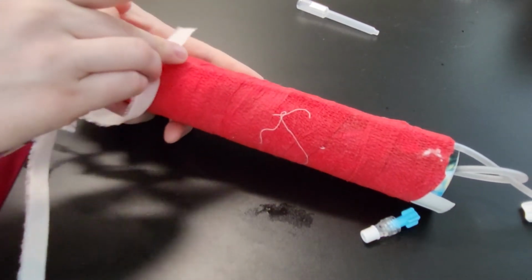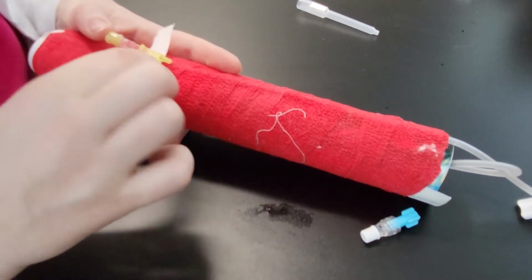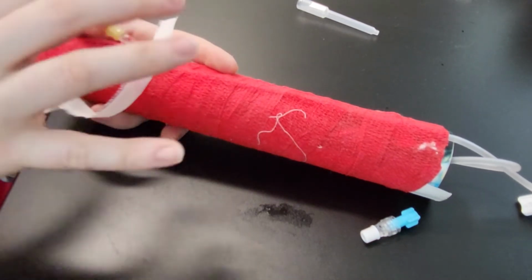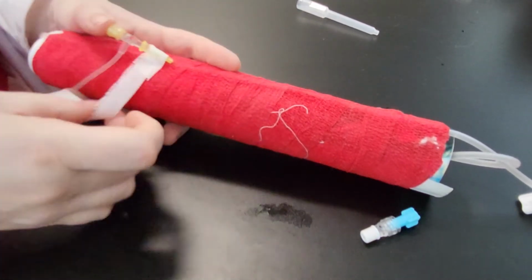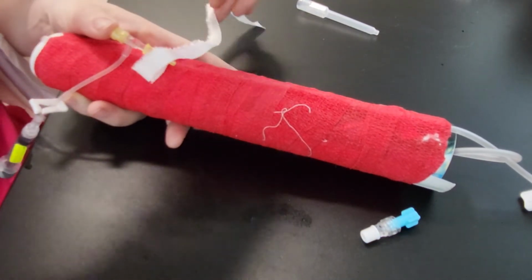When you are holding your catheter, you want to make sure you're not putting too much pressure because you can actually kink the catheter at the insertion site. So we try to just be kind of gentle, keep it stabilized, but you don't have to push very hard. So I will fold it over, and then I will fold it over one more time, as you see here.